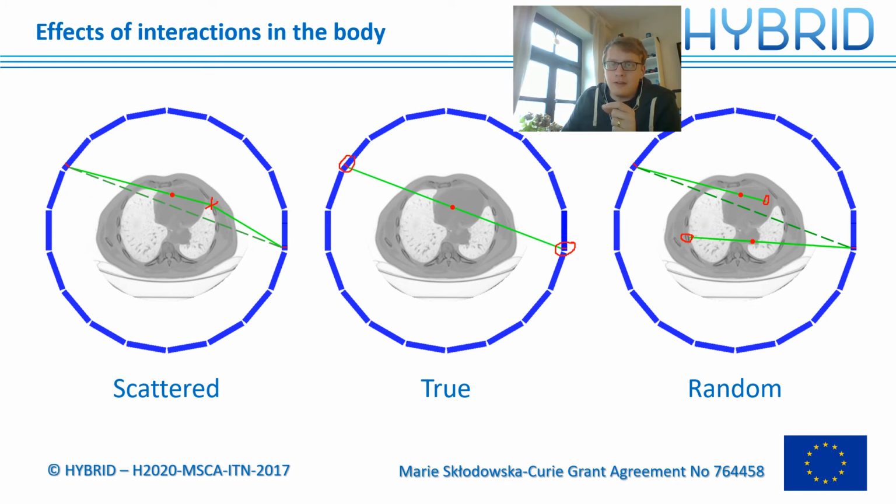So you think that those two particles you measured here belong to one annihilation around here, while actually there were two annihilations taking place at the same time. So those are some problems, based on the interactions of the gamma particles with matter.